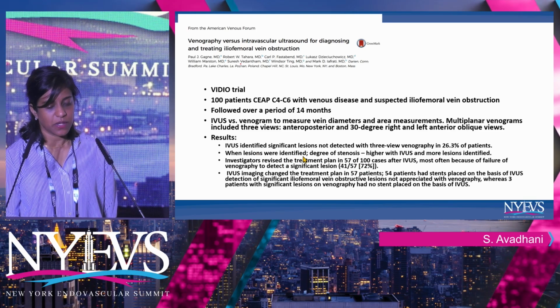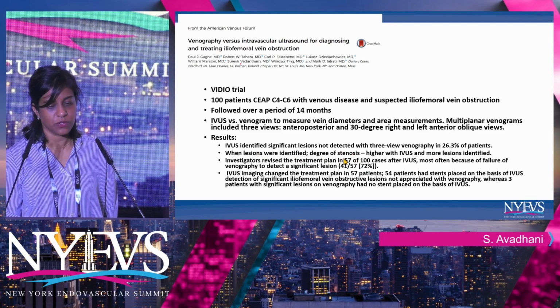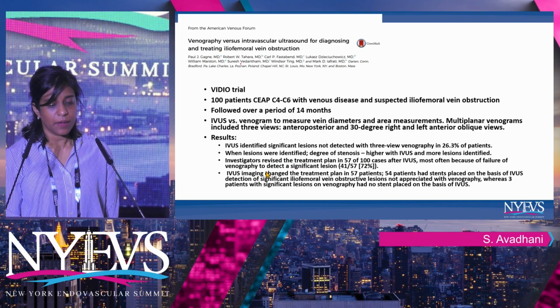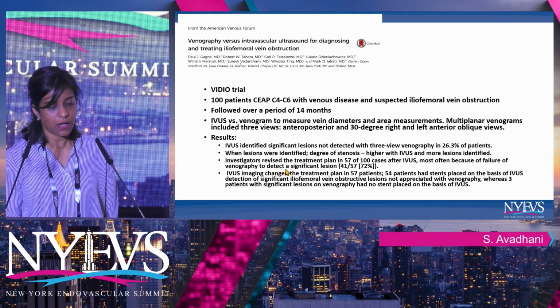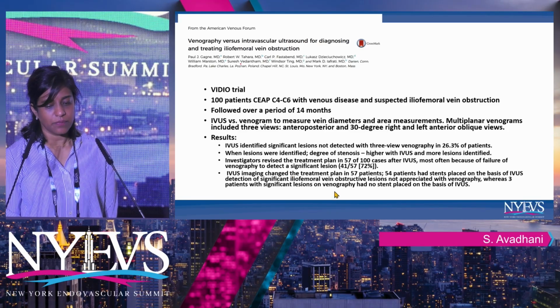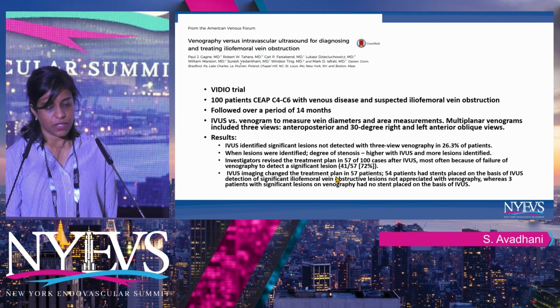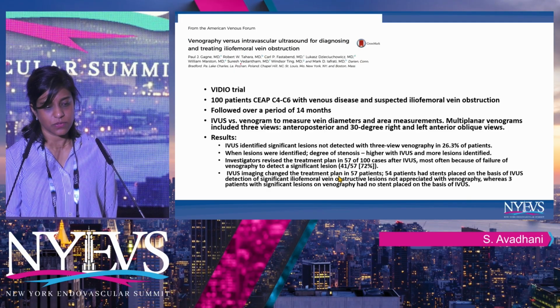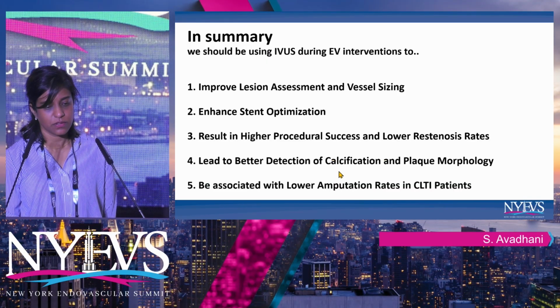And when these lesions were identified, the degree of stenosis was much higher with IVUS, and there were more lesions identified. There were no clinical outcomes in this trial, but IVUS changed the course of the treatment plan in more than half of patients, which was also impressive.